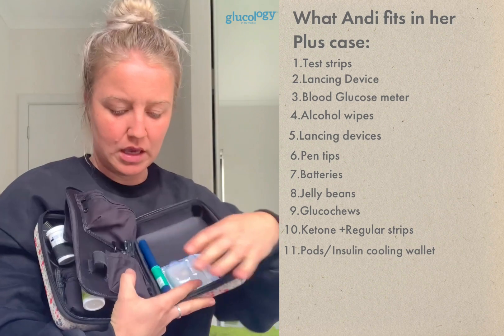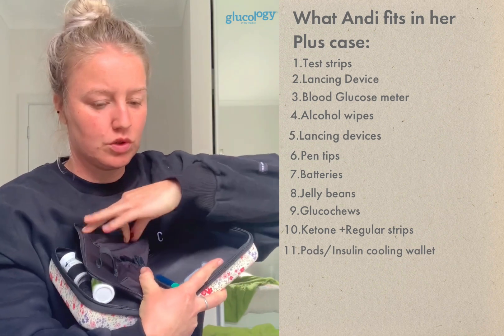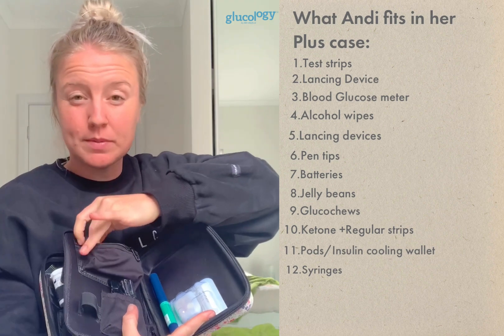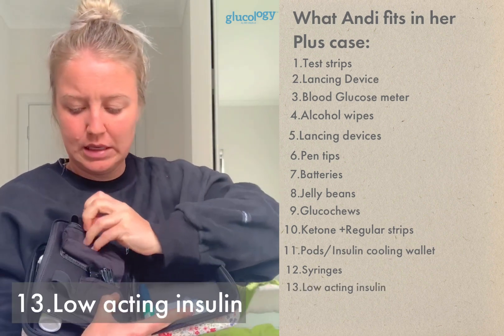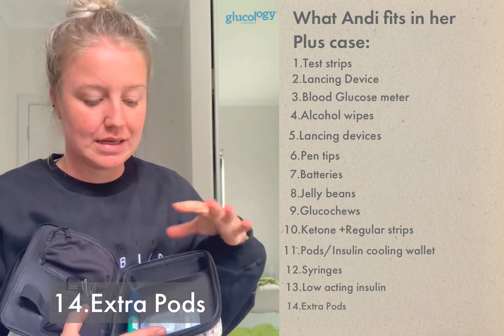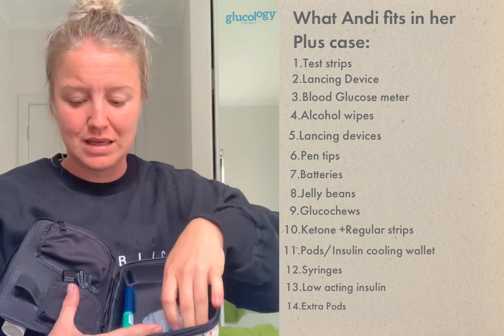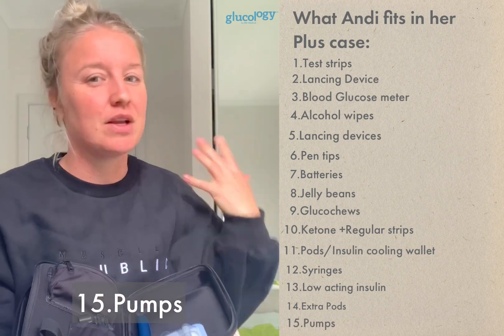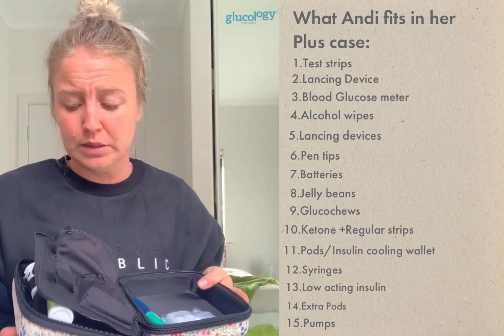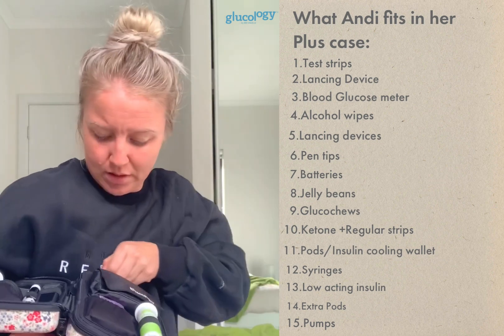In that back section I keep old-school syringes for corrections if my insulin pump stops working, long-acting insulin, my Levemir, and pods — I like to keep at least two in there at once. There's easily room for four pods, plus pump clips and other extras. There's so much room I never even use it all.